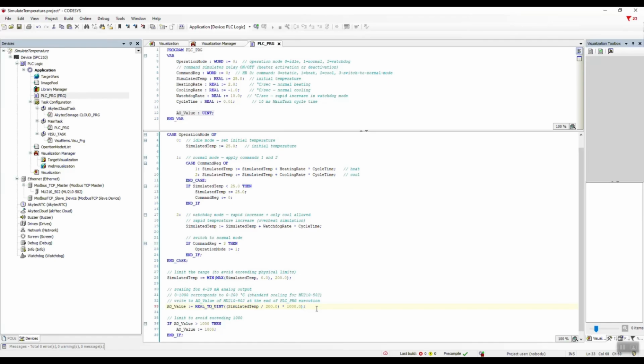With this signal, we can encode the temperature for our range from 0 to 200 degrees Celsius with an accuracy of 0.2 degrees Celsius. But this accuracy for our range can be improved. Write in the comments if you know how to do this, or maybe you want me to show this method in future videos. Write in the comments what the last condition is for and whether it is necessary.